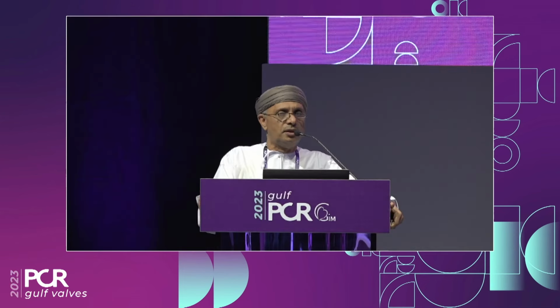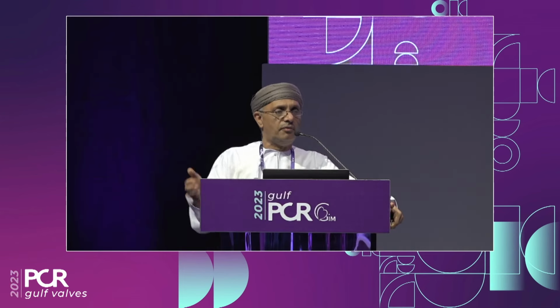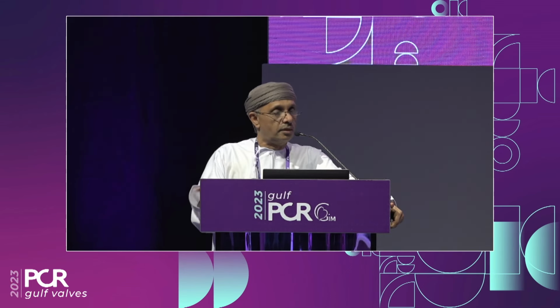I really don't recommend to do it because I had one case with it and she had a bad stroke, honestly. Usually when you reach the limit you're going to use balloon, there is a lot of calcium. So you don't need the balloon. Just snare, contralateral access, load the snare, reach there, pull the snare, and you are okay. This is actually with all systems. Now with the new systems, especially the FlexNav, you can negotiate through very tortuous aorta, even that acute angle and horizontal aorta. We didn't have a single problem with this in this case.